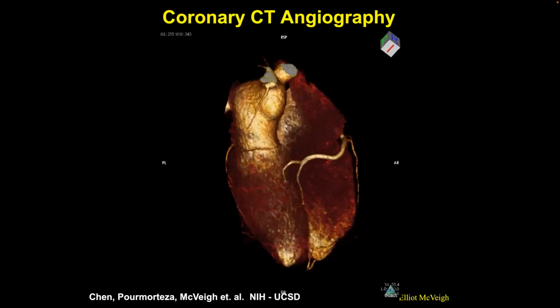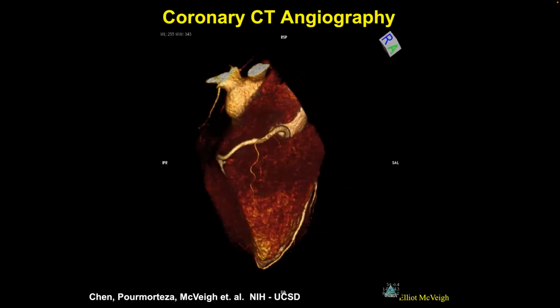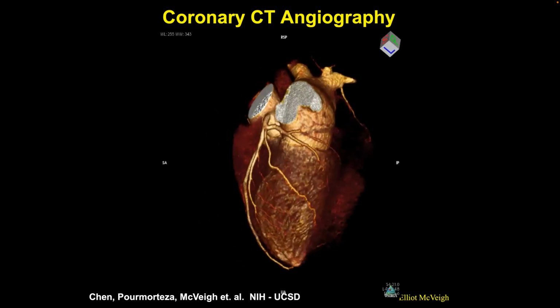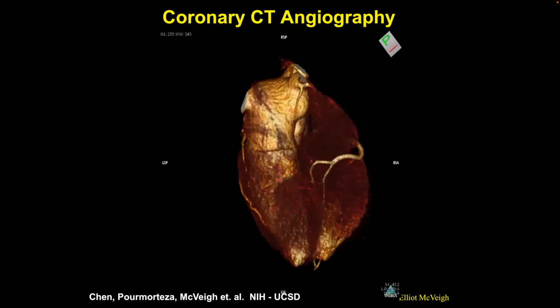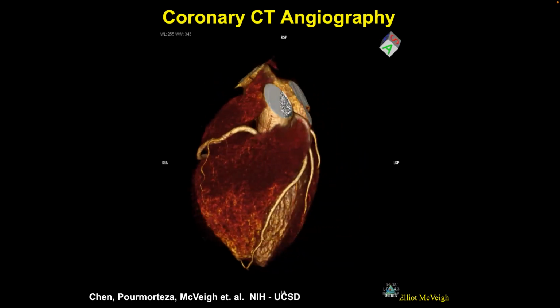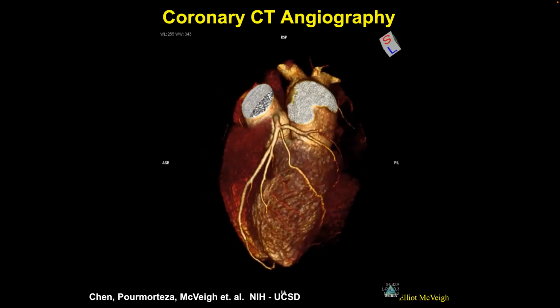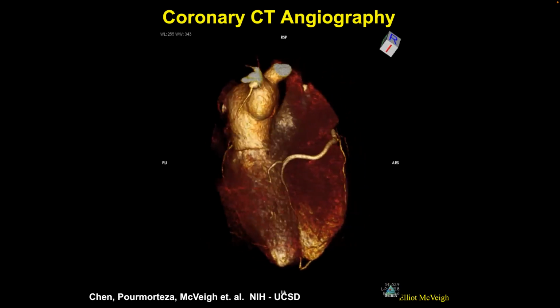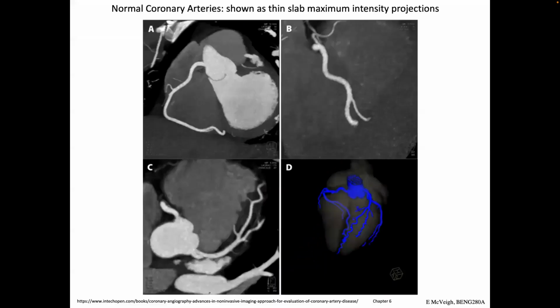And so, I did MR for, I don't know, 30 years or something, 25 years, and we never saw anything like that, right? In 150 milliseconds, you don't get much signal in MR, but in CT, 150 milliseconds, you get a lot of signal, and you can make these fantastically high resolution pictures really quickly. So I think it's a very applicable imaging modality for all of cardiac.